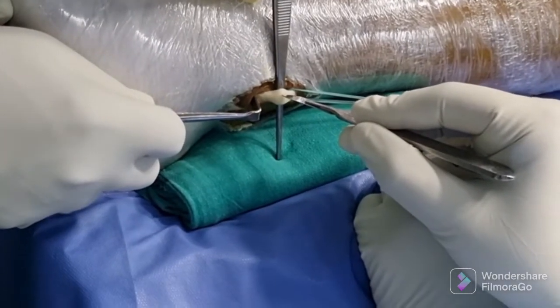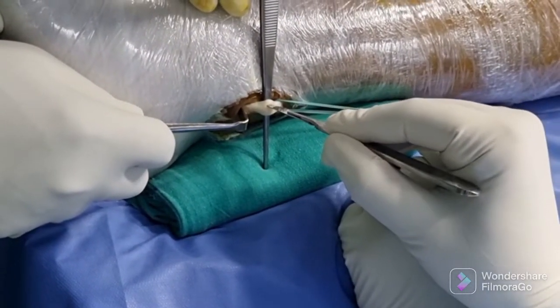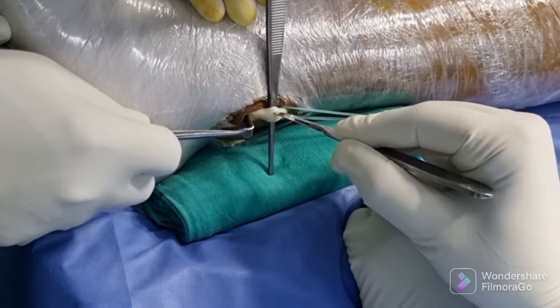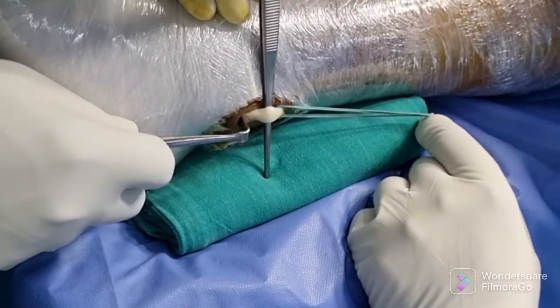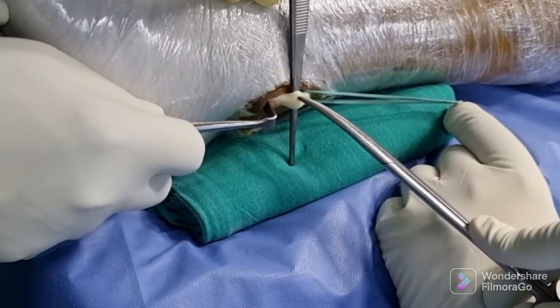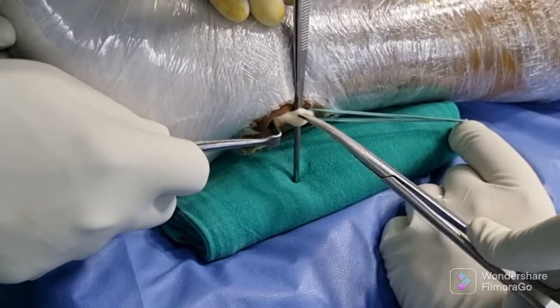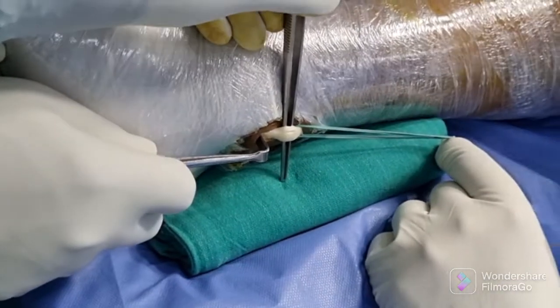Once you deliver the peroneus longus outside the wound, make a small nick, dividing the tendon into upper one-third and lower two-thirds by a sharp number 10 knife. Extend that nick proximally and distally.